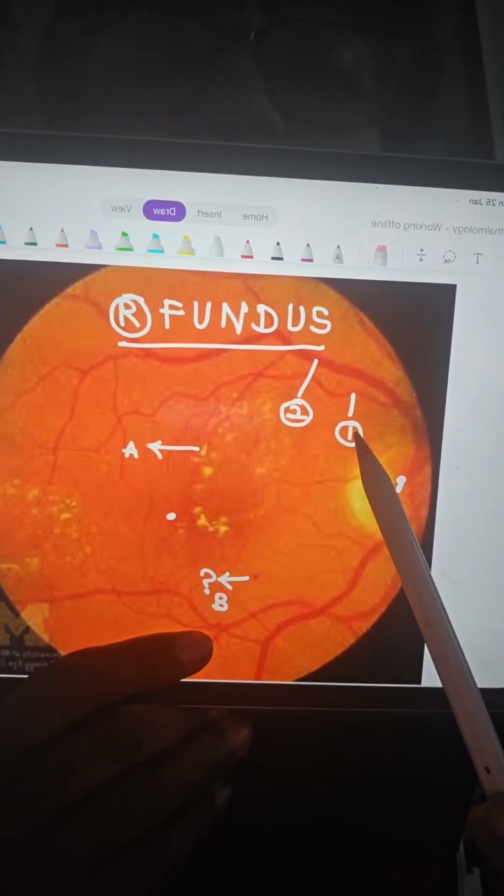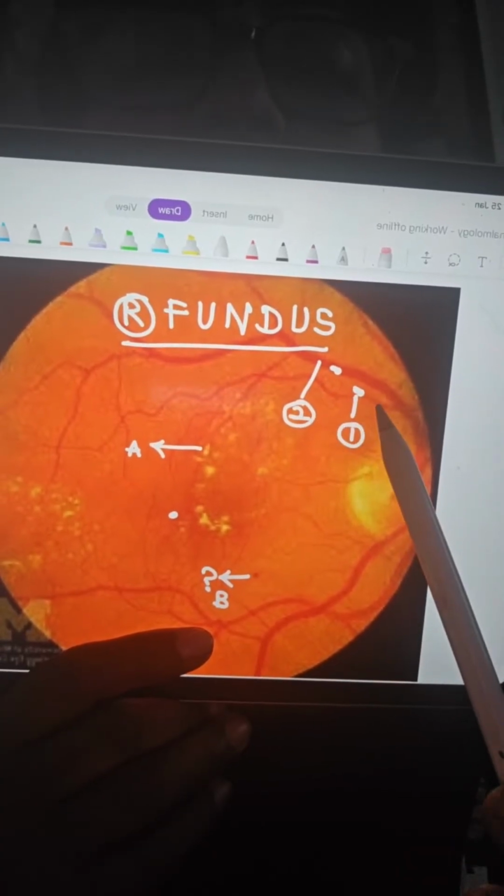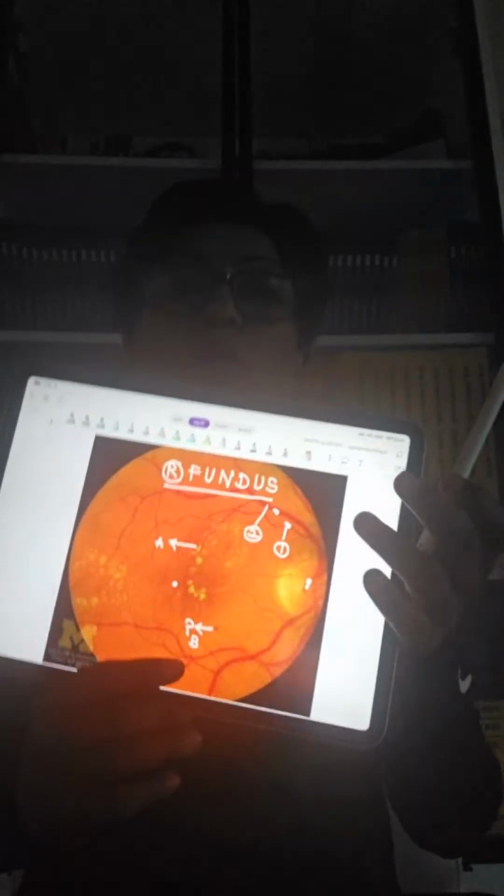You're going to tell me the structure and then we move forward to the clinical findings that I plan to teach you today. I've actually taught you this.